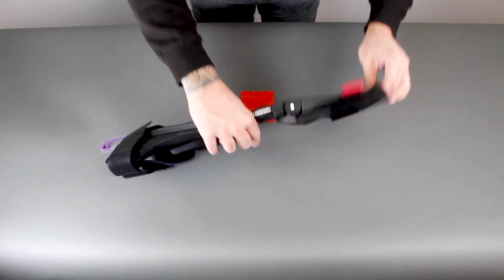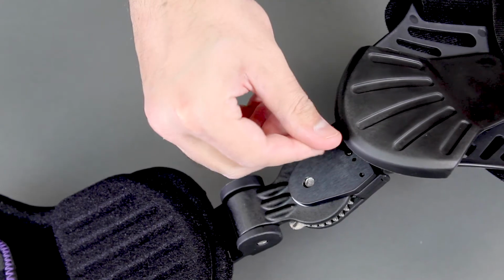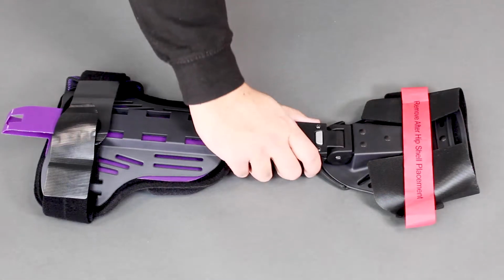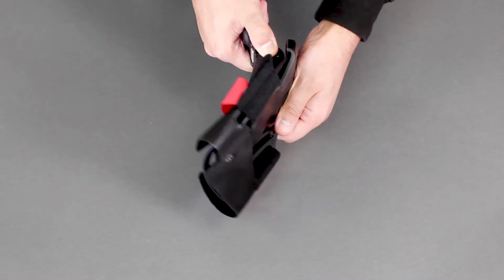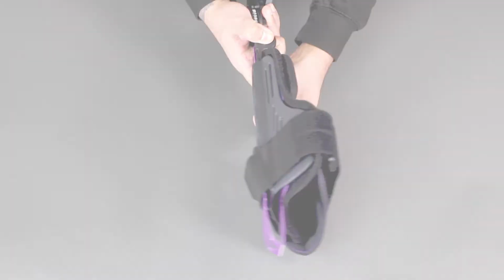To lock the hinge, once the desired flexion and extension has been set, turn the brace over. Adduct the pelvic shell and insert the screw, which is included in the red bag with the product's instructions. To set the pelvic shell hinge, press the button in on the side and set to the required position. To set the abduction, press the button in on the side and set to the desired position.